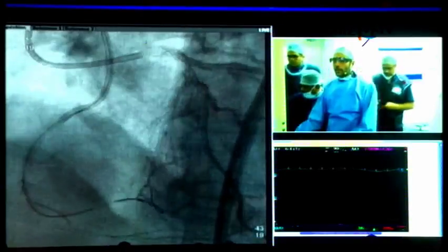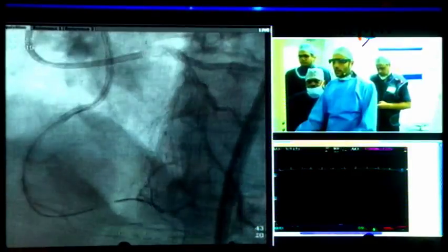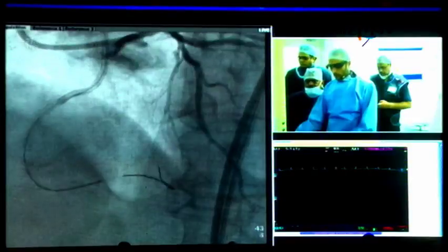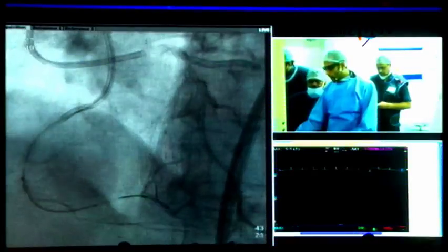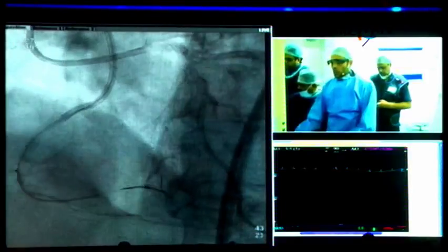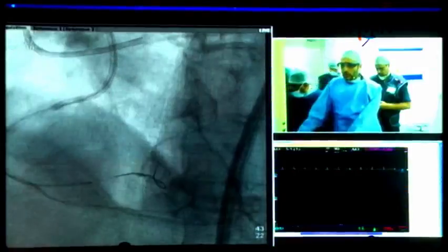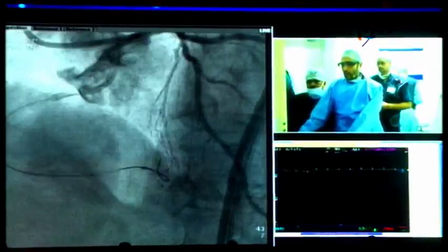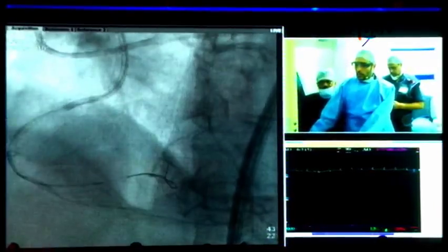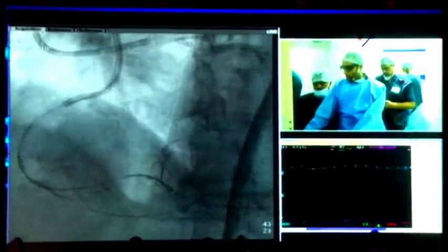Or I might do a blind double stick and swap at the distal edge. I don't know. One question is, will you do an ADR again? Will you take the ADR again, that we need to take Stingray and gold wire? No, that's the thing. Even to start with, it looked like it was a small enough vessel and a very, very short landing zone. So, I mean, we could try it, but I got to talk to Boston about whether everything is free.